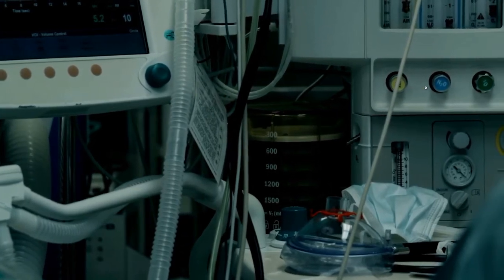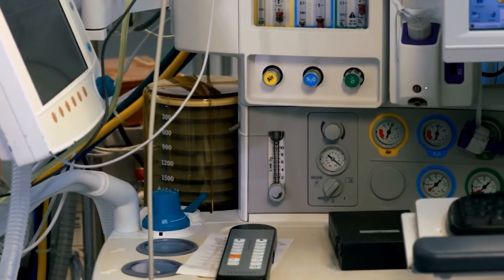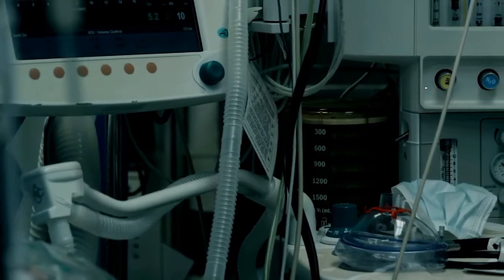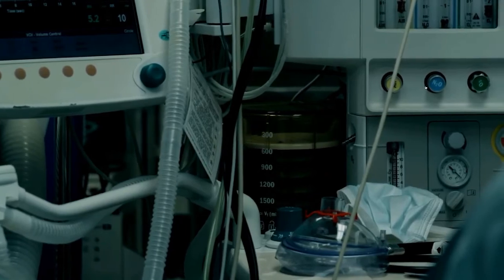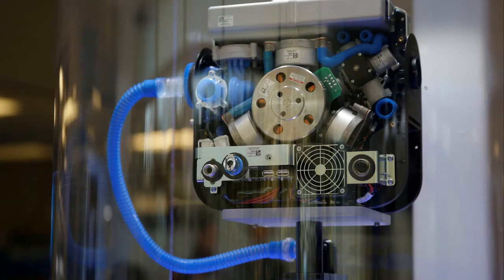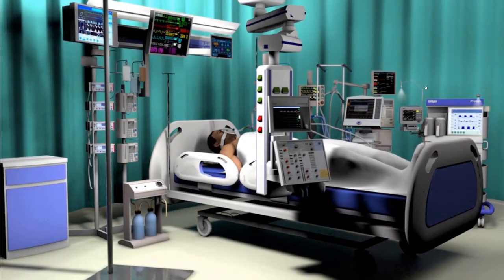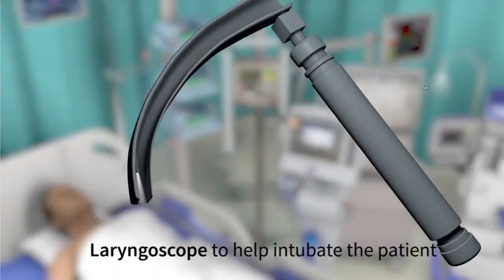A mechanical ventilator is a machine that helps a patient breathe when the patient is unable to breathe on their own. A mechanical ventilator pushes a mixture of air and oxygen into patients' lungs. Modern ventilators are complex machines and they require comprehensive training of both the nursing and medical staff to operate them safely. Here is a short film courtesy of AFP to explain how ventilators work.